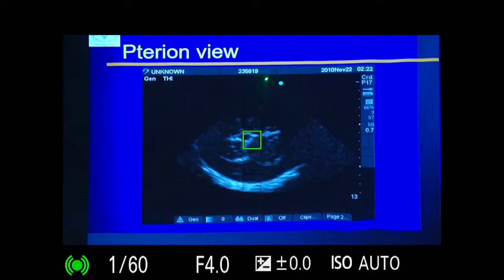You measure from the probe to this side and measure from here to here, and then you keep it on the opposite side and again do the same. So then you have an average value and you can calculate what is the midline shift. Understood what I am saying? So you can actually calculate the midline shift in any patient using the ultrasound, and again you can triage patients based on the midline shift.